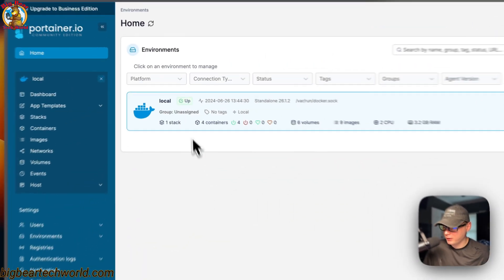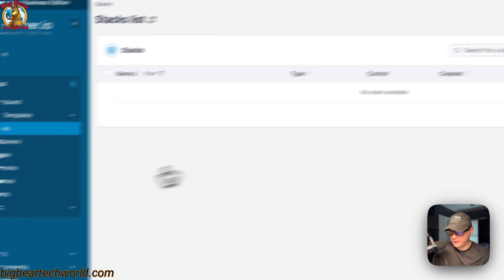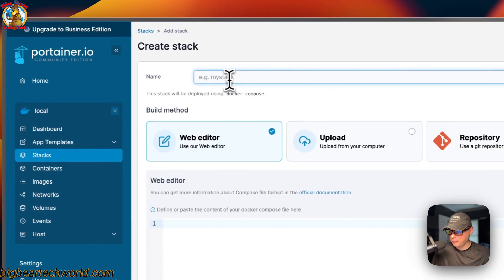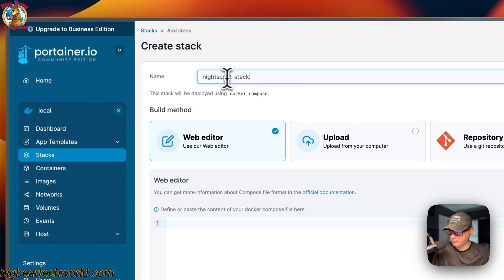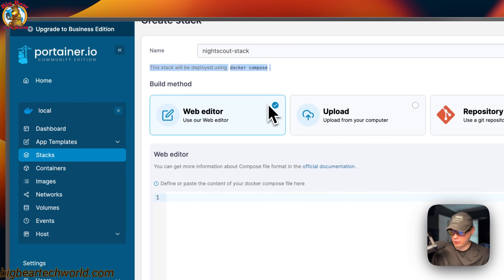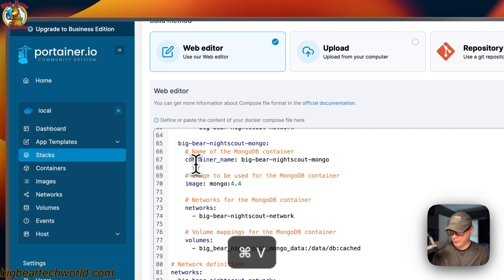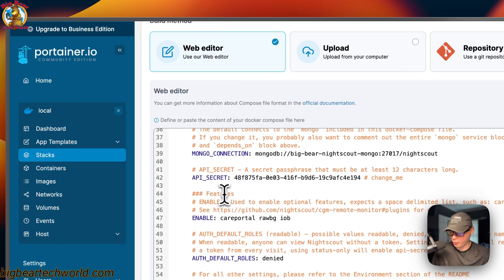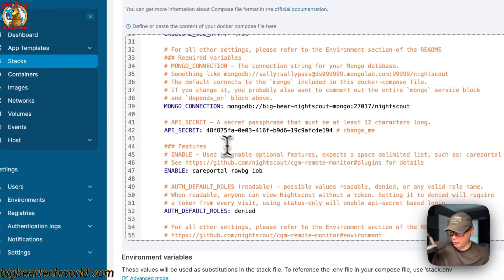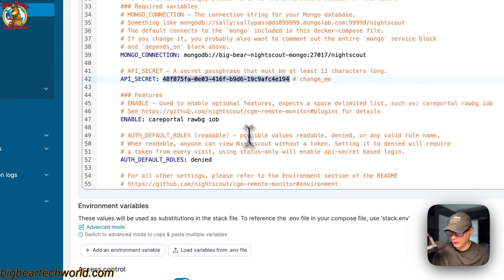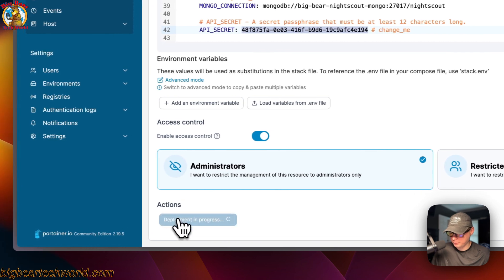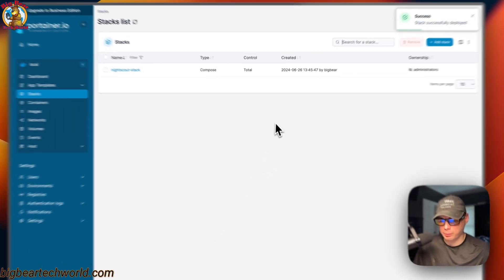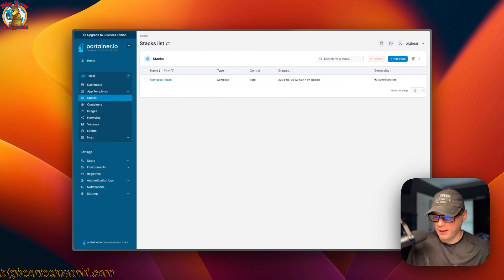In Portainer, I go to Local, then Stacks, then 'Add Stack'. I'll give the stack a name of 'nightscout-stack'. Portainer stacks use Docker Compose underneath, so it is using the Docker engine. I'll come down to the web editor, paste in the Docker Compose explained in Big Bear Video Assets, and you can change the API secret here if you'd like.